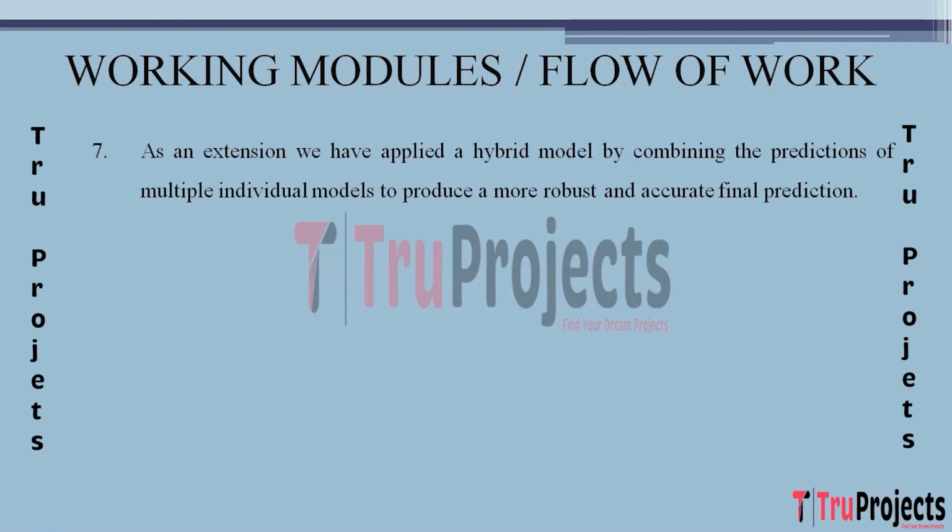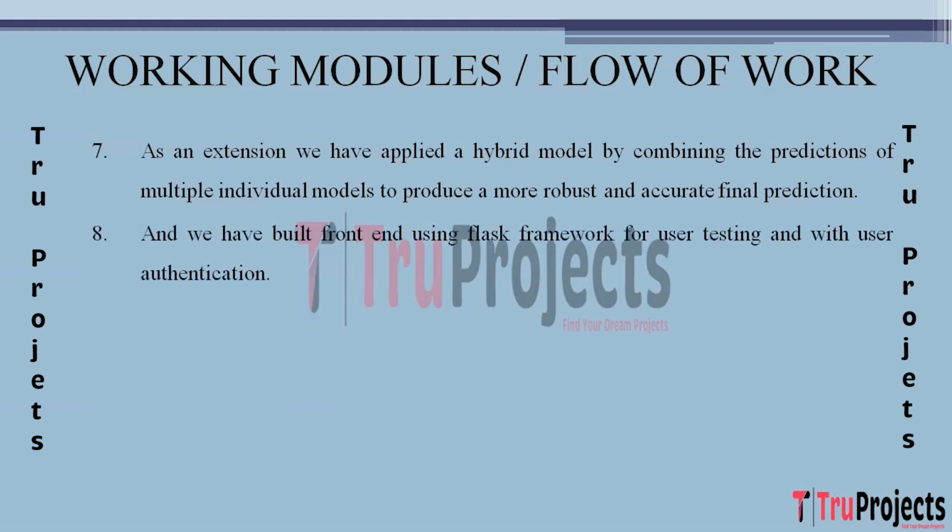After the training phase, we will assess the performance on a separate test dataset using metrics like accuracy, precision, recall, and F-score to determine their suitability for real-world application. Additionally, a user-friendly Flask-based front-end with authentication was developed. And the next step is Flask framework with SQLite for sign-up and sign-in.